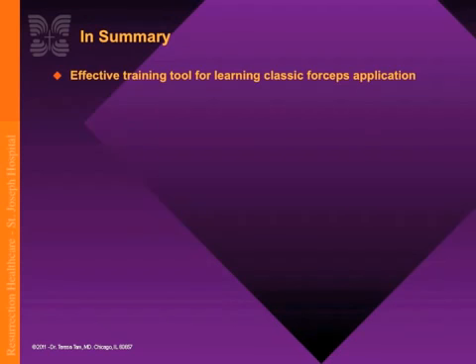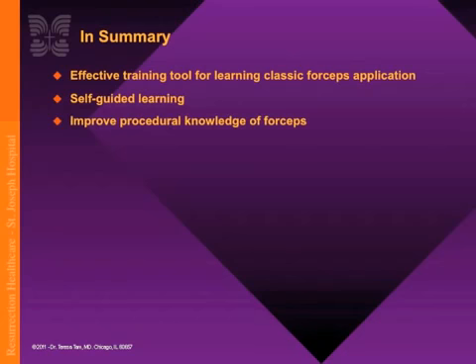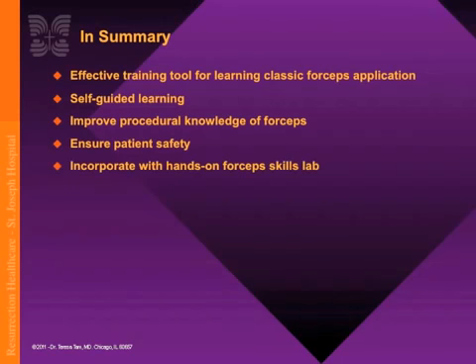In conclusion, this educational video provides a useful, practical, and effective training tool for learning classic obstetric forceps application. The self-guided learning will improve procedural knowledge in forceps operative delivery without compromising patient safety. Incorporating this forceps program with a hands-on skills lab will provide a complete educational experience.